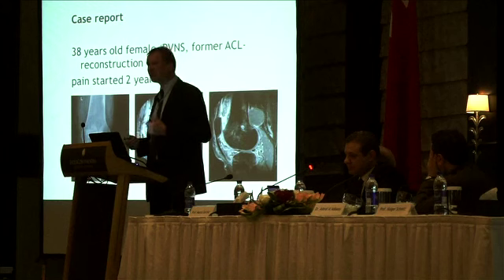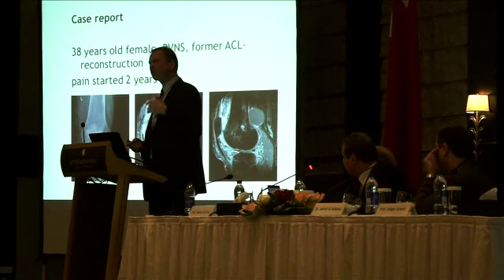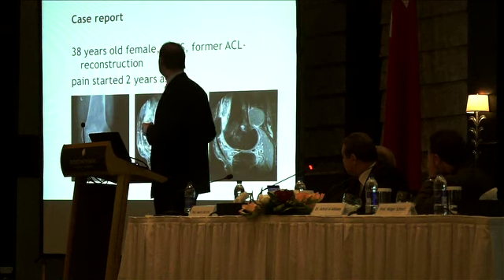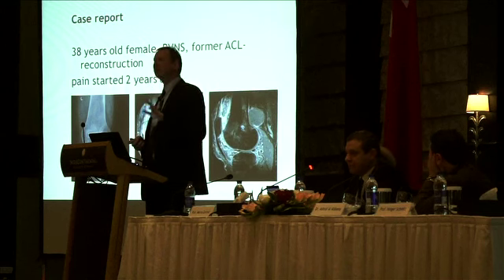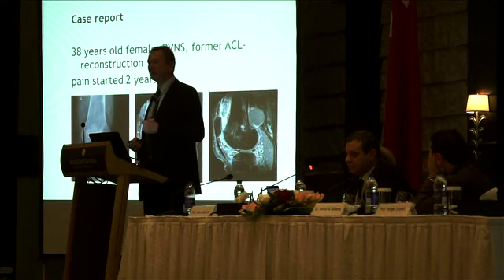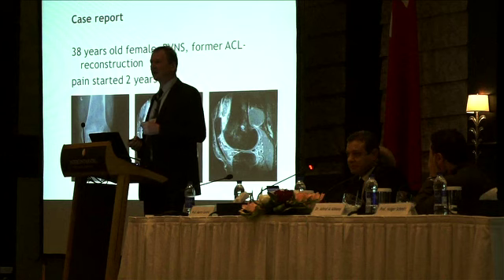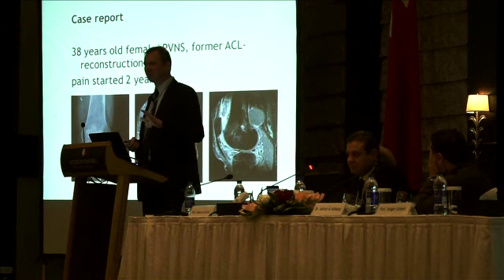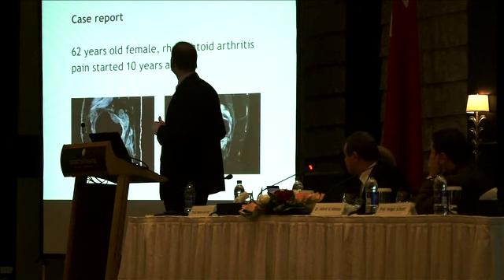So what can we do in this case? In this case, we did an open anterior and posterior approach to remove the synovia, and then we filled the bone with bone to prepare the implantation of a knee prosthesis, maybe in a few years. Now, the patient feels very much better, but we cannot say what will come in the future.